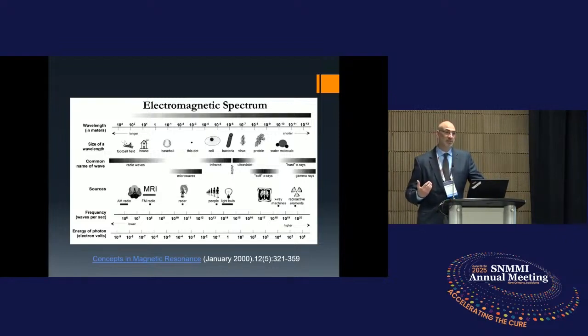But the amounts of radioactivity we actually use are extremely small, and they're not going to cause long-term damage by having an imaging study. In other parts where we use it for treatment, and there are parallel sessions, as you may be aware of, with radioligand therapy and different types of therapy, those use a little bit more dangerous types of radiation. We have to be careful about how much we're giving because we want to minimize any damage we do to the patient and really treat the disease.